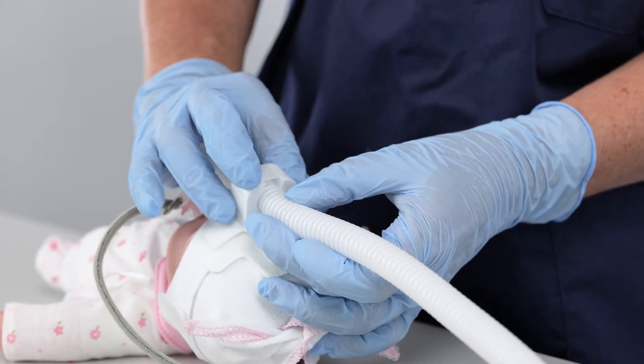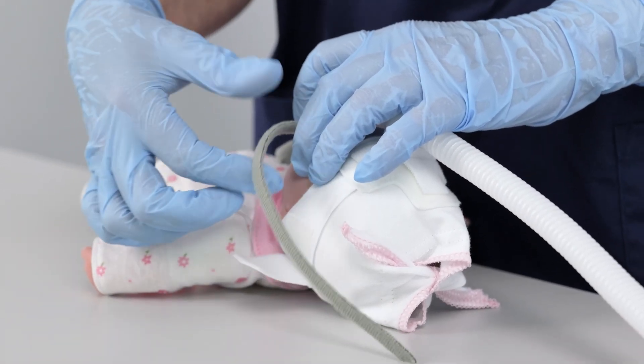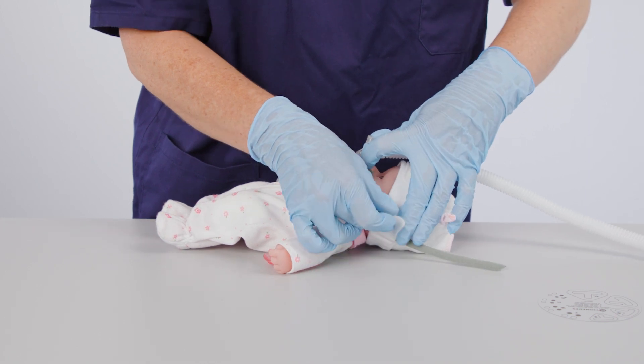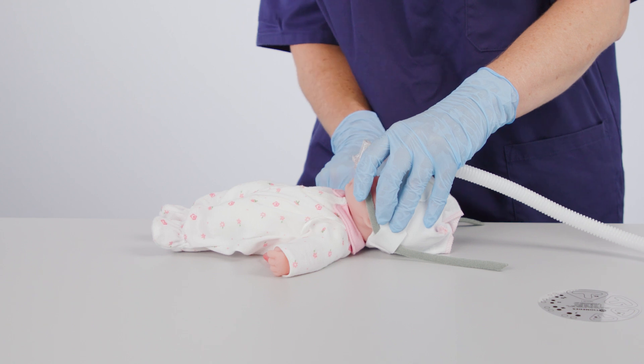Secure the generator without excessive tension. Open the Velcro on the side of the bonnet. Secure the grey ribbon onto the Velcro on the side of the bonnet and apply the Velcro to secure the generator without excessive tension.